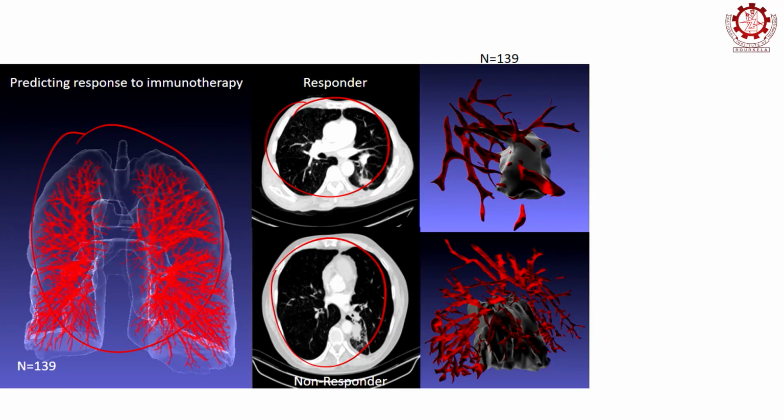Tens of thousands of voxels which are blood vessels. Now, imagine you want to sit with a clinician and you want to have them annotate every single pixel. It's almost impractical. No radiologist will have that kind of time to sit with you and give you annotations for these blood vessels, right? So, which means that we have to come up with innovative, smart ways to identify where the blood vessels are.